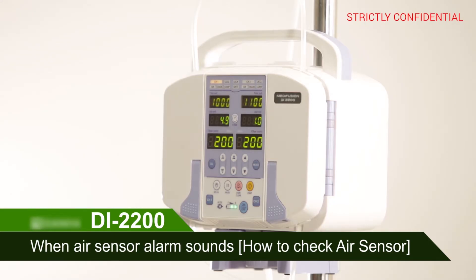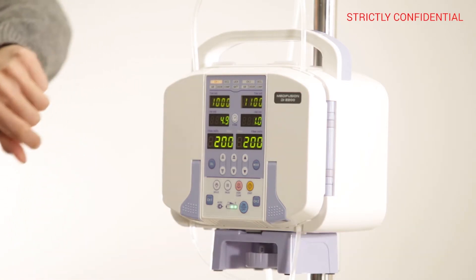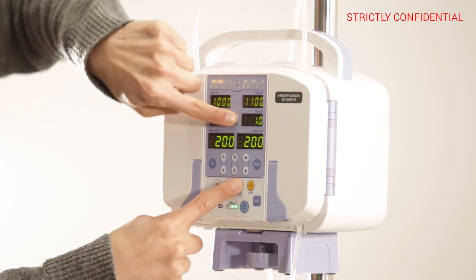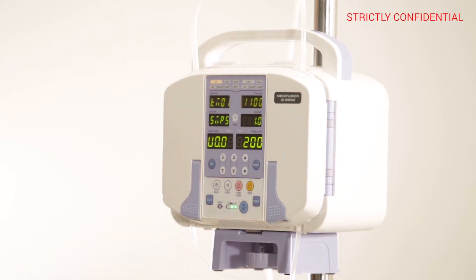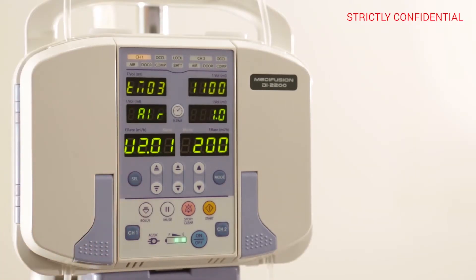When the air sensor alarm sounds, how to check the air sensor. After activating CHANNEL 1, press the R-TIME and STOP button at the same time for 3 seconds to enter the service mode. Press the SELL button twice to enter the air mode.